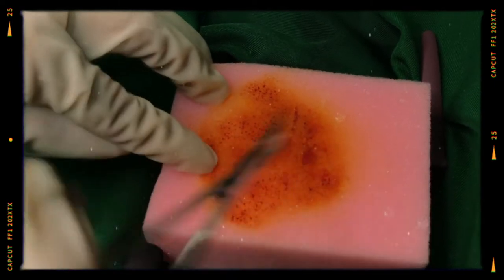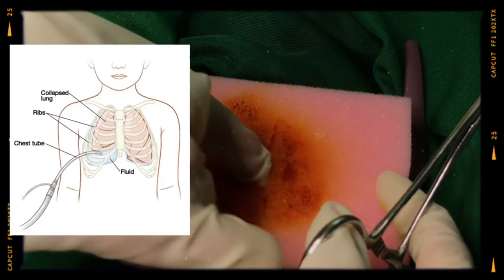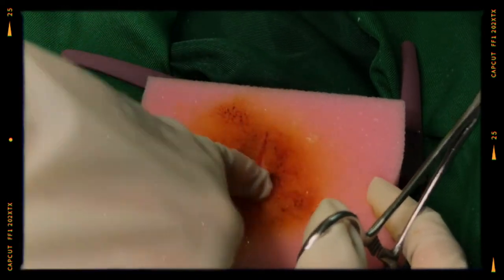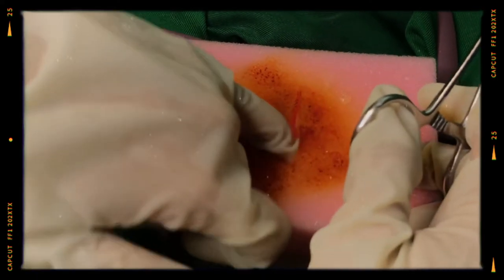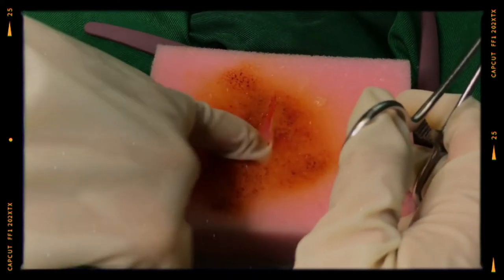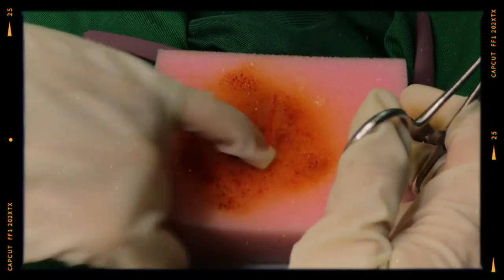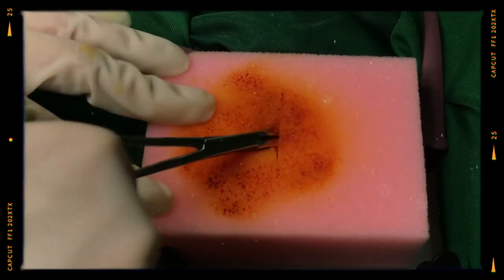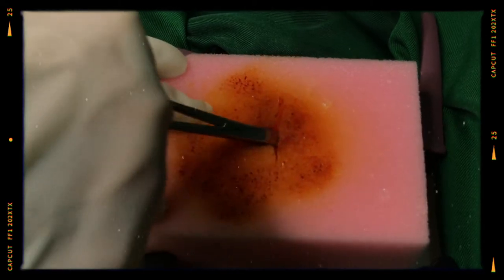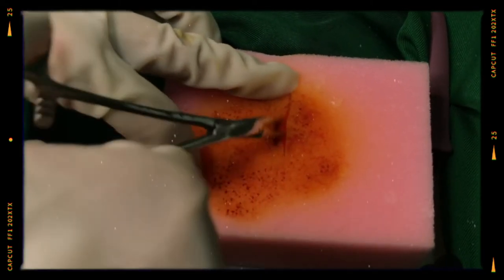This track should be directed posteriorly, cephalad and medially so that the tube lies posteriorly in the paravertebral gutter. Continue developing this track all the way into the pleura. Remove the scissors or clamp and explore the track with a gloved finger from time to time to make sure that the track is going in the right direction.